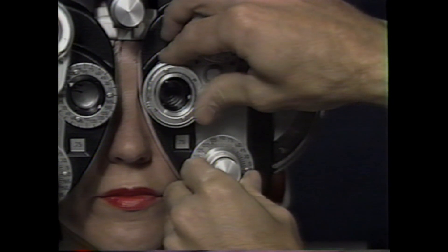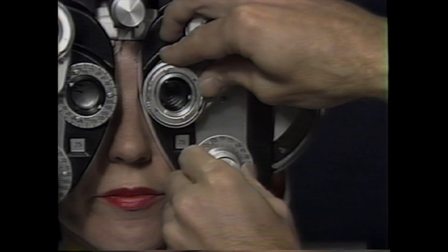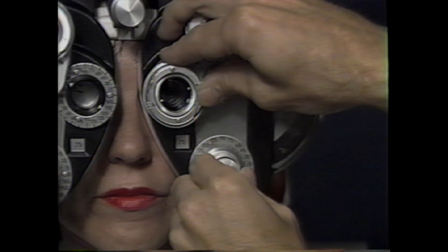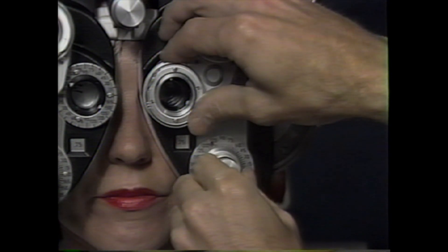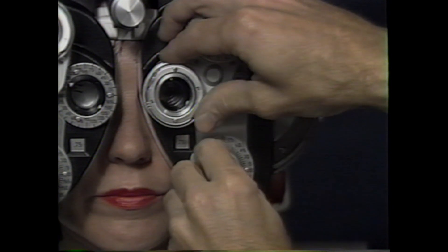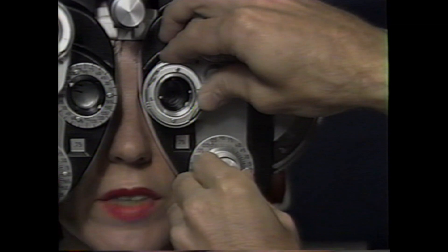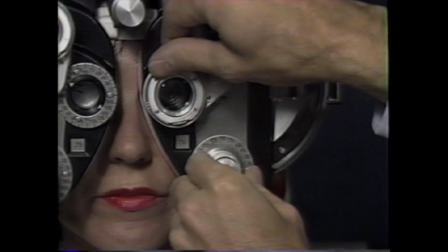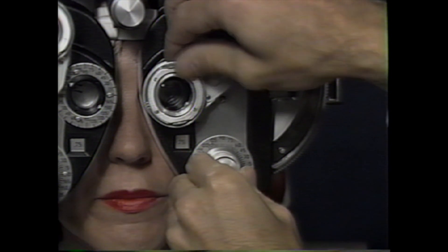Now three or four? Three. Three is better. Five or six? Five. Good. One or two? One. Good. Three or four? About the same. Good. Once again, which is better, one or two or about the same? About the same.